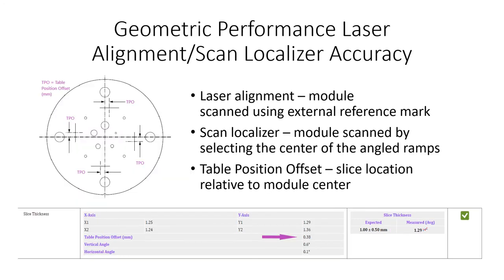Verification of laser alignment and scan localizer accuracy is reported as the table position offset parameter, displayed as TPO. The table position offset is the distance between the wire ramp center and the module center, then converted with the tangent of the ramp angle to the z-axis offset.